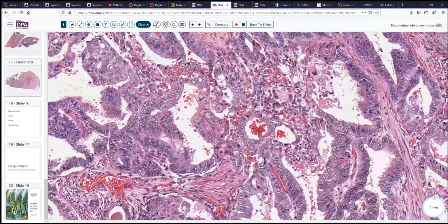So we've talked about some of those features in terms of the logistics of measuring and grading. What else are we concerned about with endometrial carcinoma? Well, in our institution, and I think for most places, determining whether or not the patient is microsatellite unstable, whether they have a mismatch repair defect, is important, because that's going to govern some of the treatments available to them, and also may impact other risks of malignancy if they are a Lynch carrier with germline microsatellite instability.